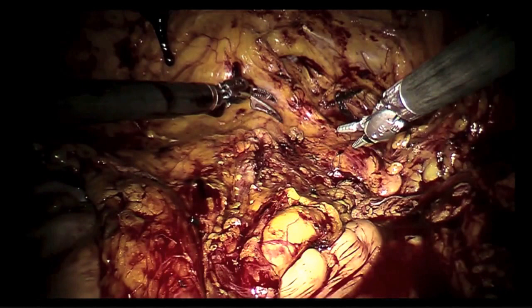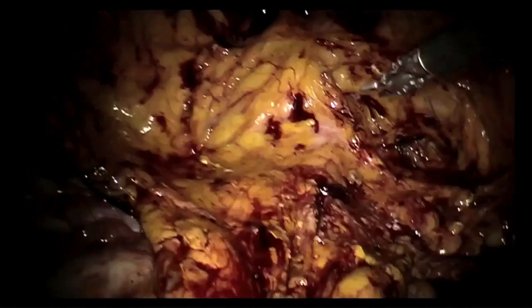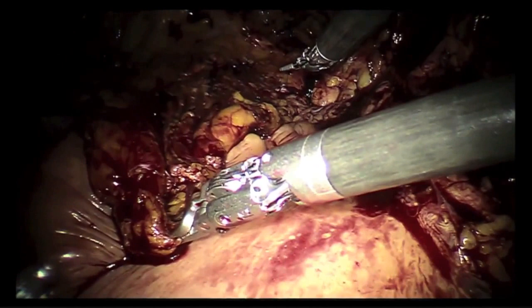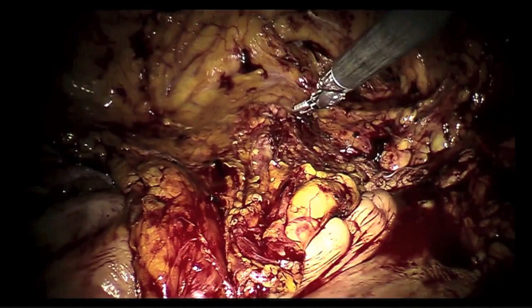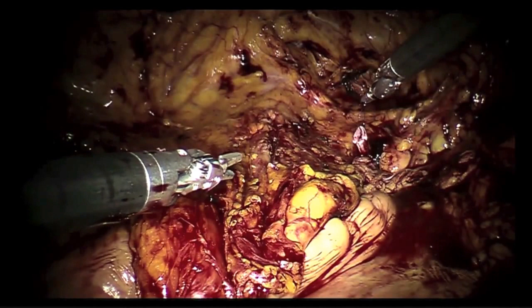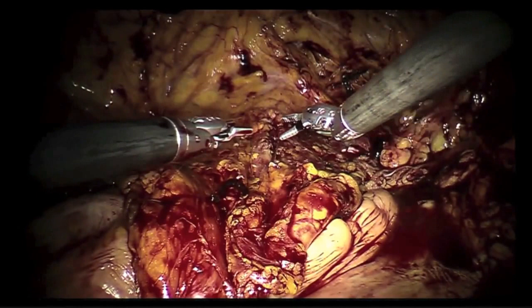Can I have another needle driver, please? But again, given that we have ice around it, the kidney is really not taking a hit during that. For the idea of doing pancreas and kidney robotically, you know, pancreas can bleed like hell. I know. After revascularization. Very good point. So you really need a very, very good back bench. You're absolutely right. So obviously, you've done pancreas transplants, and I have had the experience of doing about 19 or 20 of them. Absolutely, they bleed quite a bit, and that is the concern. But we should be able to figure out a way. Okay, now give me the double arm, please.